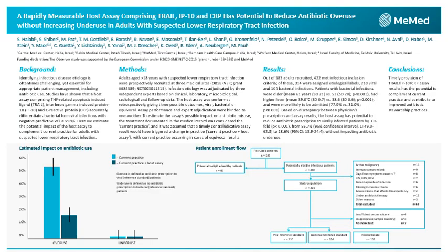So our conclusion from these data, from the Observer study and this extrapolation I've described to you, is that timely provision of this host assay result, the host assay based on TRAIL, IP-10 and CRP, has potential to complement current practice and contribute to improved antibiotic stewardship practices.